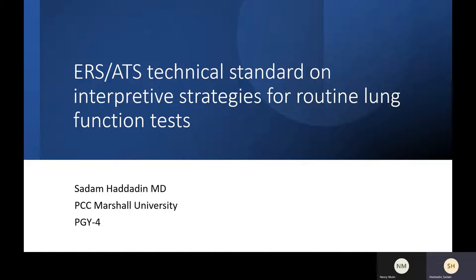Right? Yeah. Number one, the most important thing is you will not miss the abnormals in the young age and the normals in the old age. Because if you get an 85-year-old doing spirometry and a 17-year-old doing spirometry, the upper limit of normal and lower limit of normal for the 17-year-old is different than for the 85-year-old. If you do it with a Z-score, you will find right away whether this patient falls within his age group or not. And the other one, and again, if you recall, with the spirometry, we have problems.